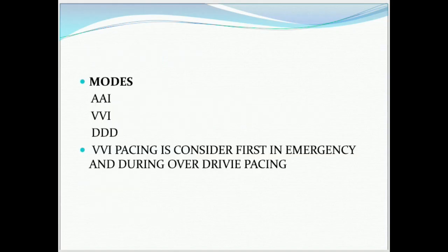Like a permanent pacemaker, temporary pacemakers also have AAI, VVI, DDD, and VOO pacing modes. VVI pacing is considered first in emergency and during overdrive pacing. AAI pacing is also indicated in case of sick sinus syndrome or in any condition associated with an intact AV node.